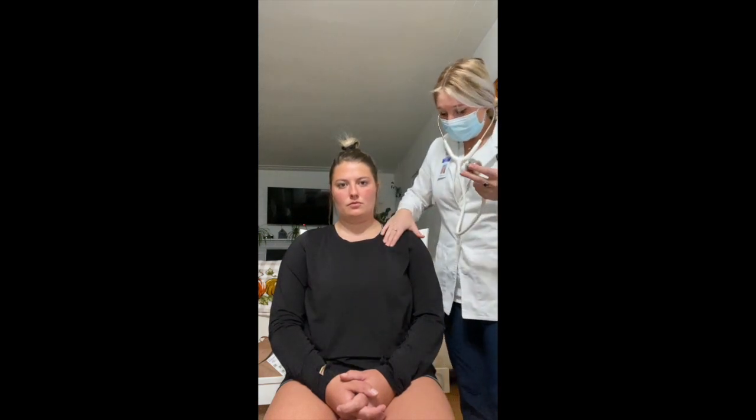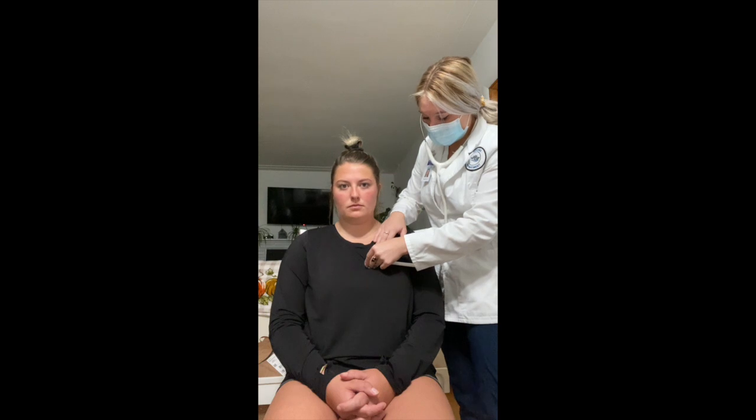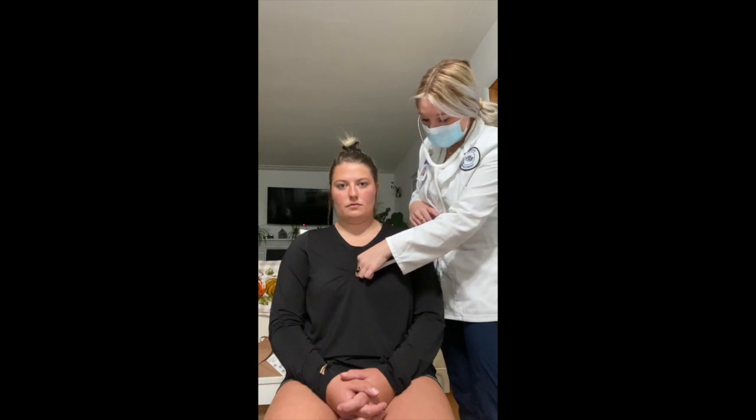So I'm going to auscultate the aortic, which is in the 2nd intercostal space down from the clavicle. This is the aortic in the 2nd intercostal space. And then on the left side in the 2nd intercostal space is the pulmonic. I'm listening there. And then we go down to the 3rd intercostal space. This is Erb's point.